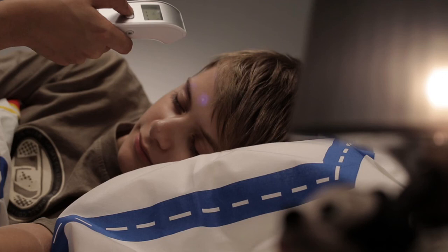The blue tracking light helps you find the correct measurement area and the correct distance in the dark, without waking your loved one.